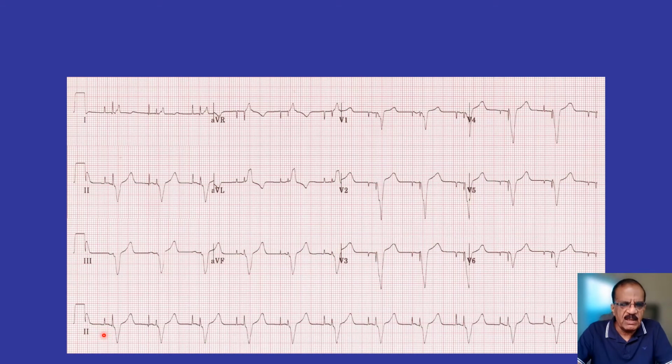This one, for example, this first one, do you think it is a P wave? No, it is not. Although the location on the ECG is exactly the same as you would have for a P wave, this is very narrow and very tall. So it's not the morphology of a P wave. Then you see another similar one, very sharp and very narrow, even taller. This is electrical activity. This one is also electrical activity.